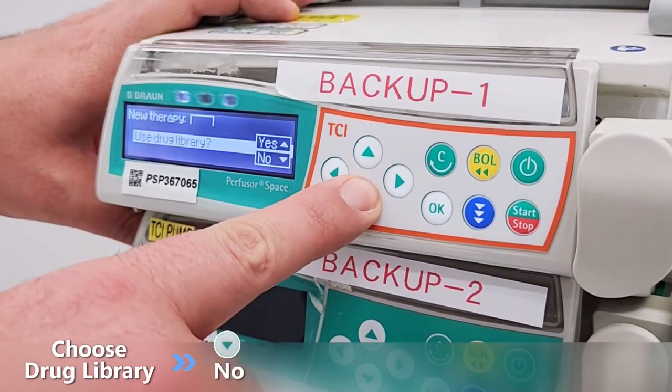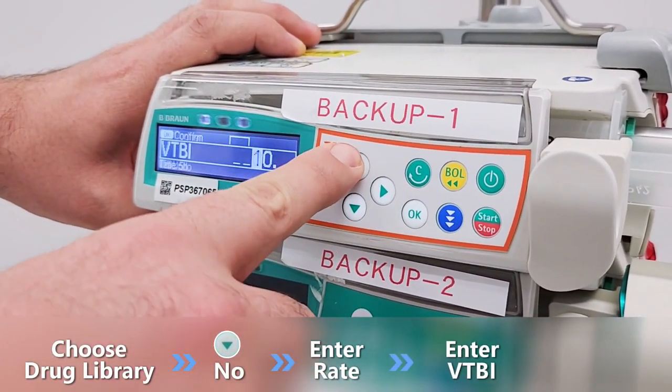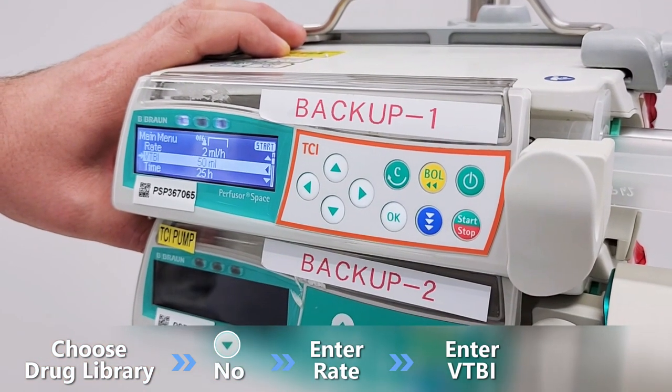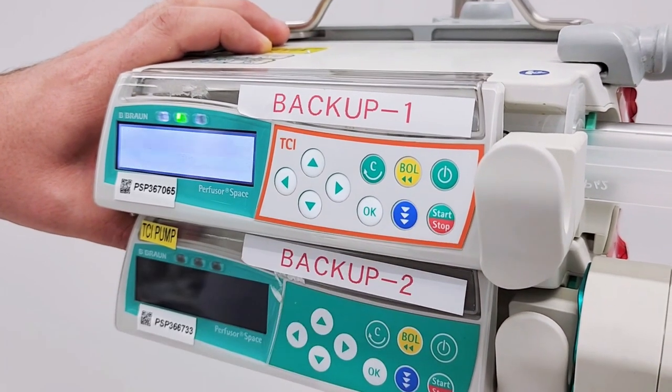To choose ml per hour, select no and enter the volume and the rate to be infused. The infusion time will be calculated automatically. Press start to start the infusion.